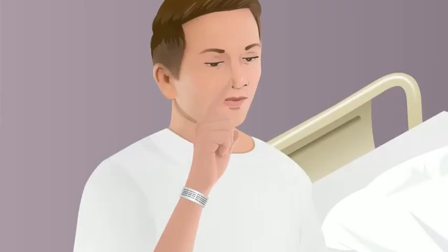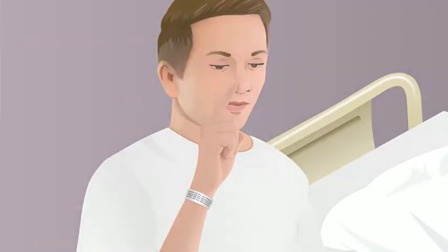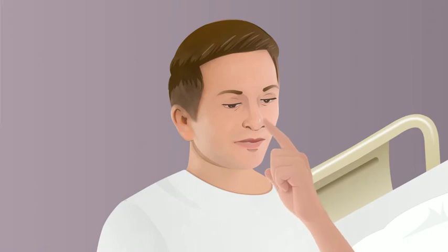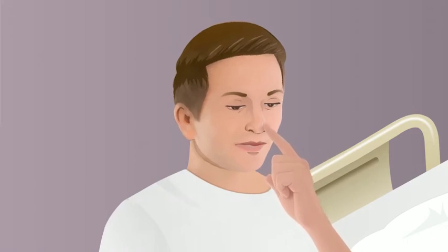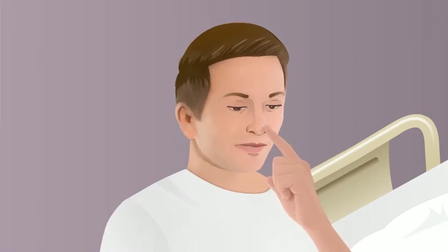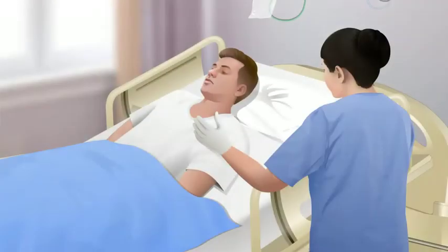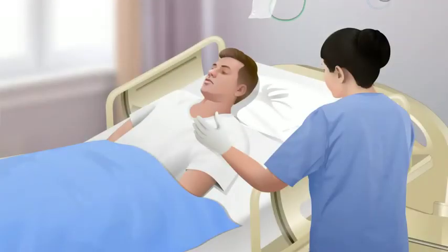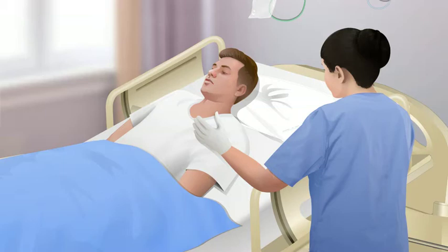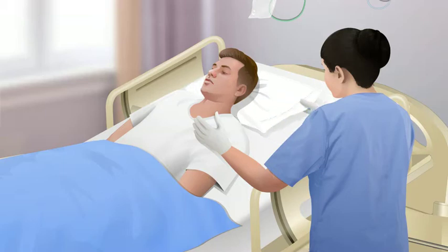Ask the patient to alternately occlude each nostril and exhale. Position the patient with his or her head back and use a pen light to check the nasal passages for patency. If the patient is in bed, place a pillow behind his or her shoulders.